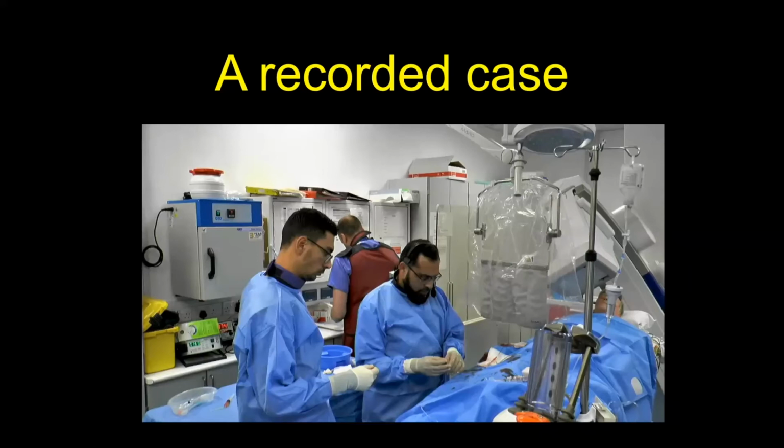And again, very small number. I have even 2 or 3 patients who, for some reason, had such a heavy thrombus burden that I had to give intracoronary TPA, which resolved their thrombus completely. We're talking about controversial topics now. I gave them a regime of antiplatelet, anticoagulant, brought them back a few days later, did the OCT, the vessel looked fine, I didn't stent it, just treated medically. But these ones have to be carefully individualized rather than just saying that we will do one thing or the other.